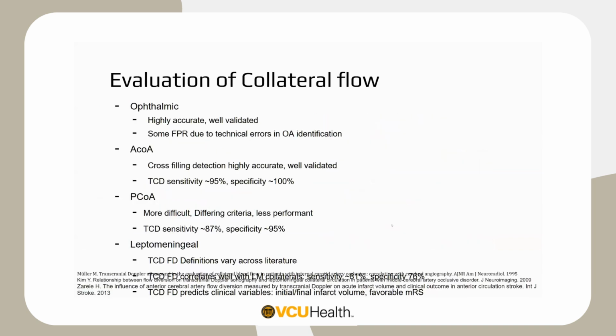Again, these have various different characteristics in terms of how well these criteria work. So in terms of flow across the ACOM or reverse ophthalmic, these TCDs seem to work really quite well, and these are well validated and highly accurate assessments, and fairly routinely used in clinical use.